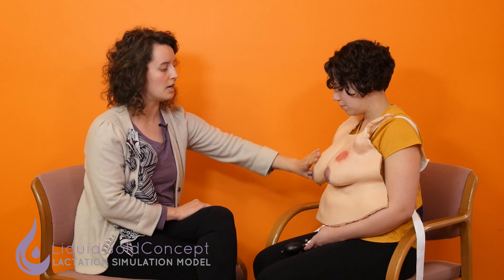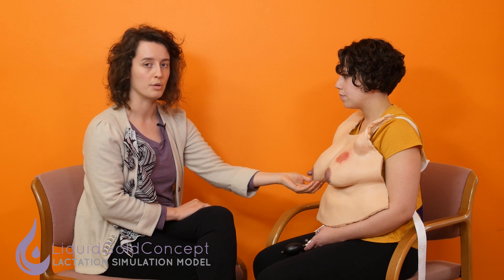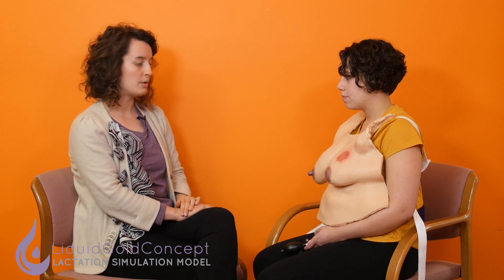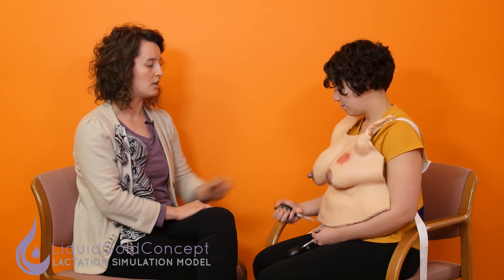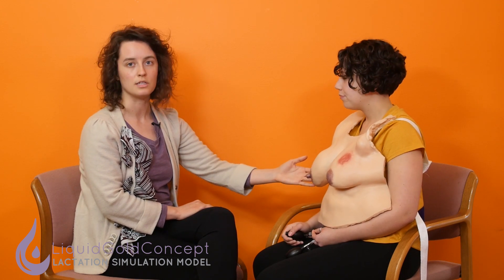Just like with the Essential LSM, we have plugged ducts on both sides. On the right breast we have subareolar and inframammary plugged ducts, and on the left we have a plugged duct in the tail of Spence. Just like with the Essential, we think it's really important that all of our LSMs are able to engorge either bilaterally or unilaterally. Sam is going to demonstrate that on the right now by turning the knob clockwise all the way to the right until it stops, then compressing the bulb until the LSM engorges to what is physiologically normal.